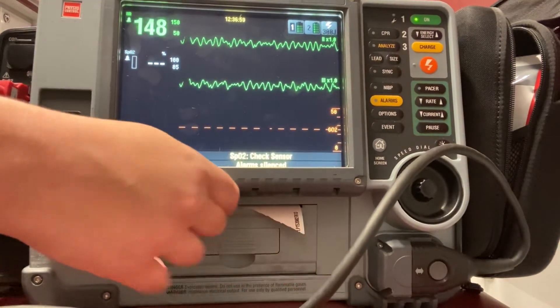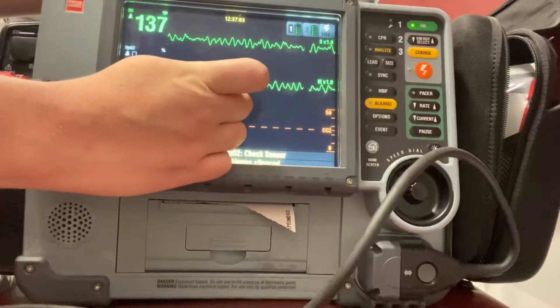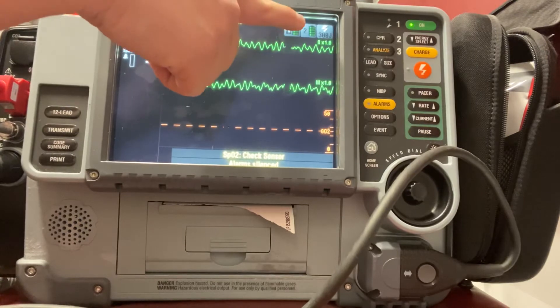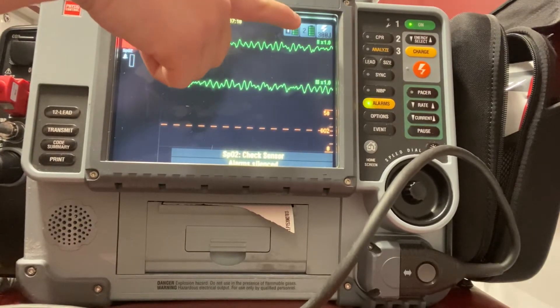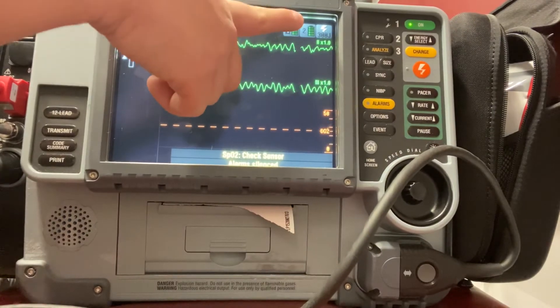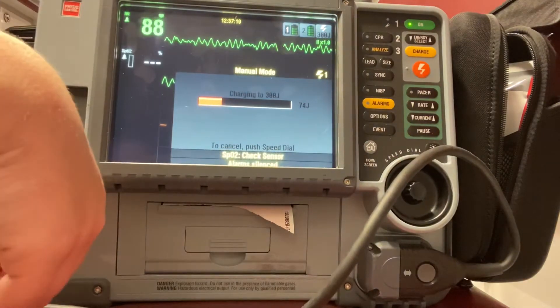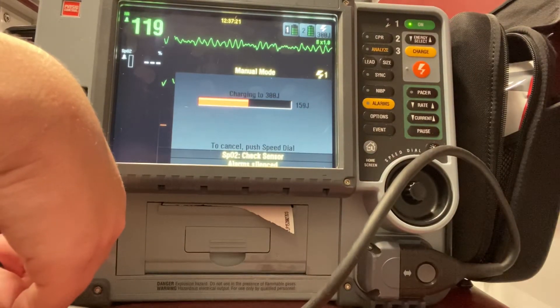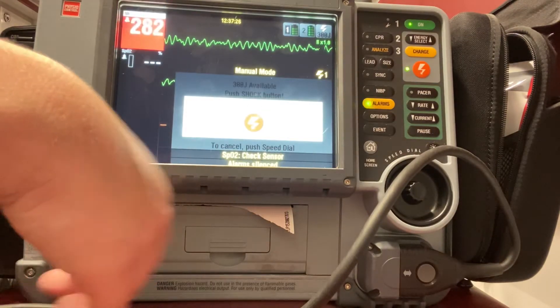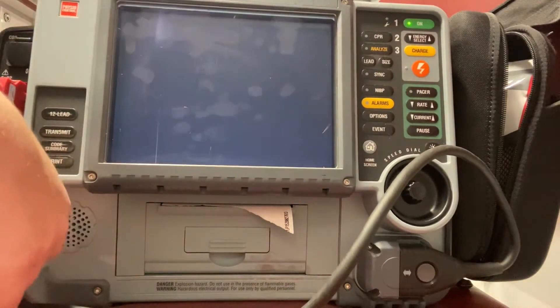With the LifePak 15 — our LifePak 12s do not do this — it's automatically going to stack my shocks. As you can see up here in the corner, it's already changed from 200 to 300. So all I have to do again is go ahead and hit charge, and it's going to charge up to that 300. Now we're clear, we're all clear. Go ahead and hit the shock button. Resume CPR.